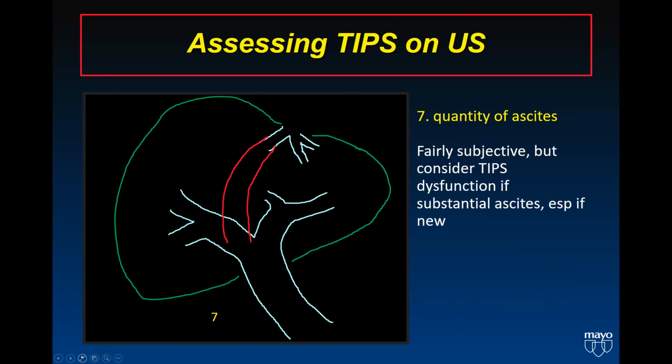And then finally, obviously, the ascites. If the ascites is getting better, that's good. If the ascites is getting worse, that's bad.